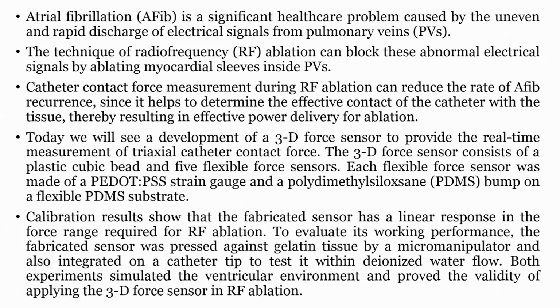So, now you know what is catheter ablation, right, and we understand that for the catheter to ablate, it can use RF frequency. So, it can be RF ablation, radio frequency ablation, catheter for radio frequency ablation for treating atrial fibrillation, correct.